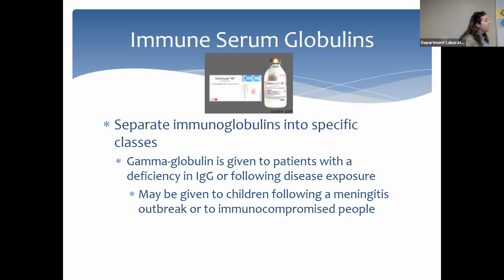I will say, if your patient is given IV IgG, this causes a huge risk or a huge problem for blood bank. Anybody want to guess why? It's IgG. And what are our unexpected alloantibodies that we try to detect most often classified as? IgG. So oftentimes, if your patient has received this, it's going to look like they have a warm auto. Okay?